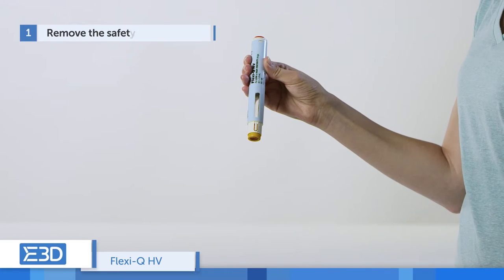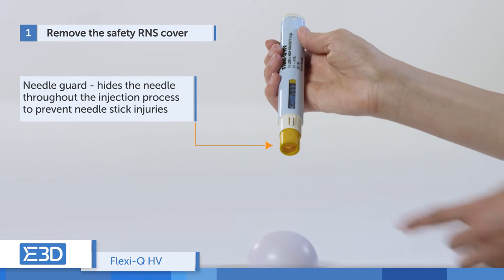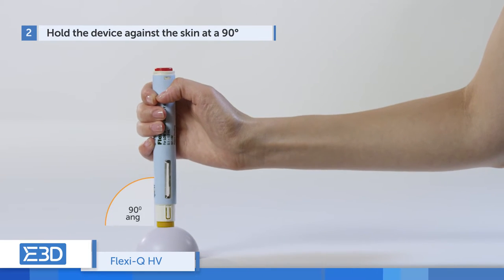Remove the safety RNS cover. The needle guard hides the needle throughout the injection process and prevents needle stick injuries. Hold the device against the skin at a 90-degree angle.